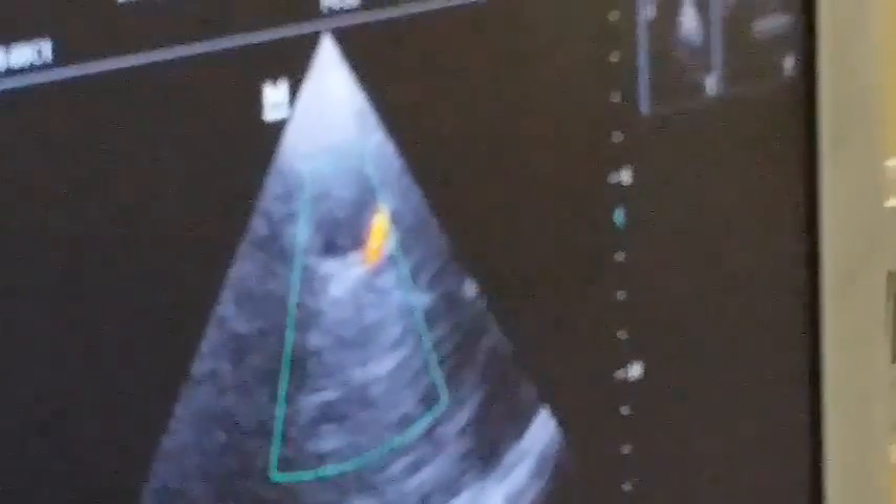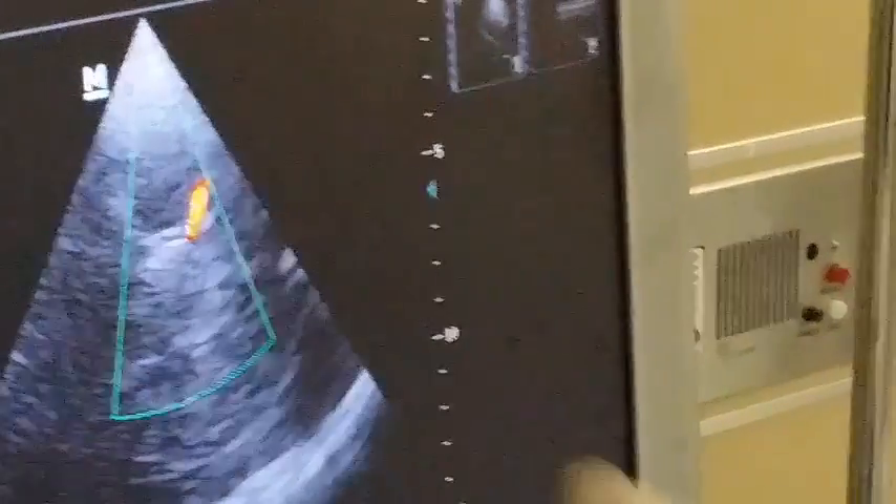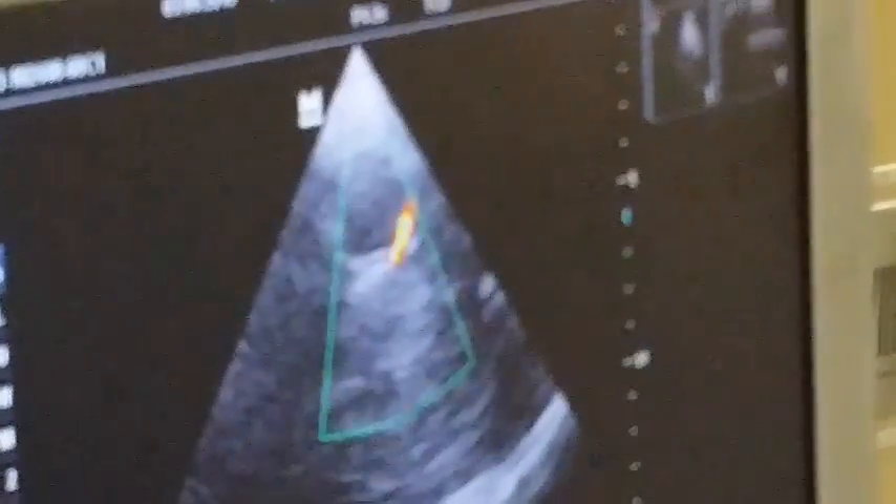Just manipulate with the probe until you get this very clear middle cerebral artery in front of the Mickey Mouse appearance.